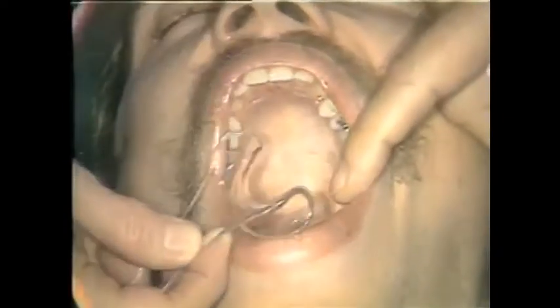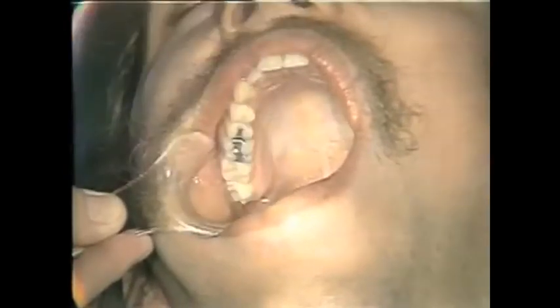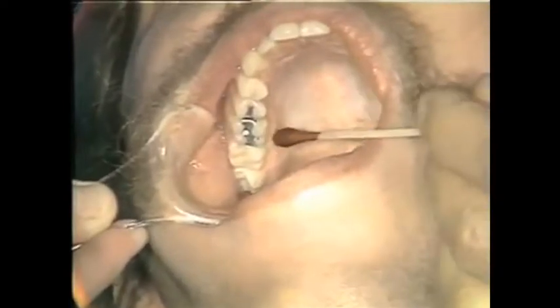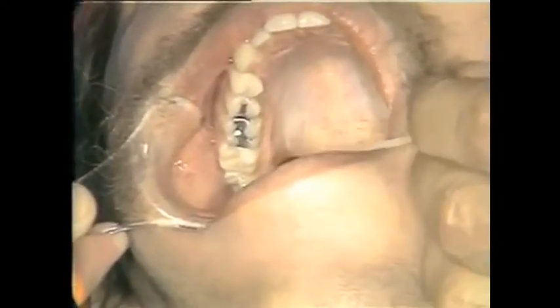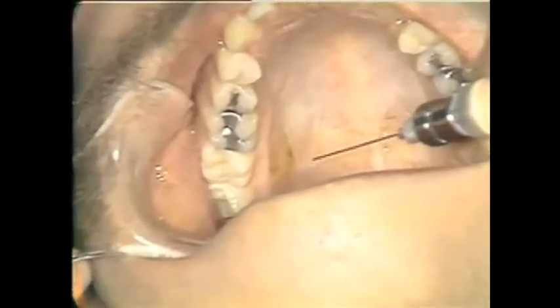All right, let us show you the anterior palatine injection on Mr. Fry. And if you'll open real wide for us. Oh, that's great. Now we'll dry the mucosa here first in the usual fashion. Just resting it there for a few moments, and then we'll apply a little betadine in our injection site. And now we'll make the approach with our syringe. Now you can see I'm at about at a level of the third molar.